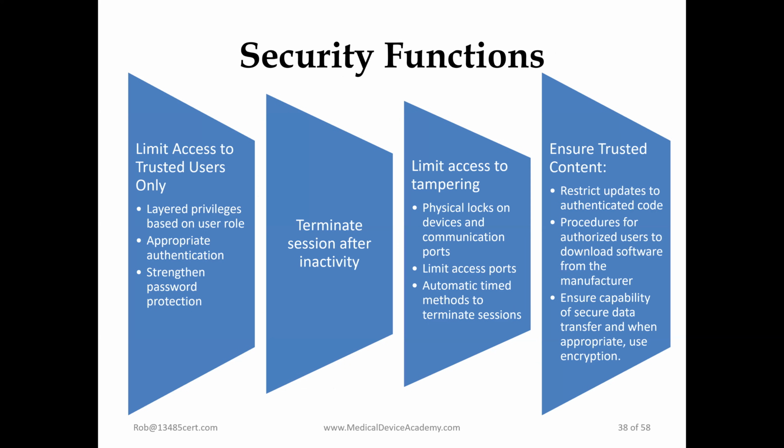So these are some of the different security functions that you can implement. These are the ones that are suggested in the guidance. The first of which is limiting access to trusted users, layering privileges based on user role, having appropriate authentication, strengthened password protection, making sure that a session is automatically terminated after a certain period of inactivity, and limiting access to tampering.